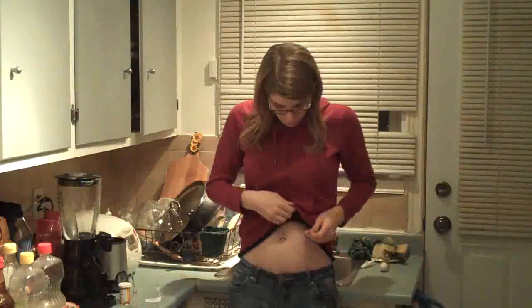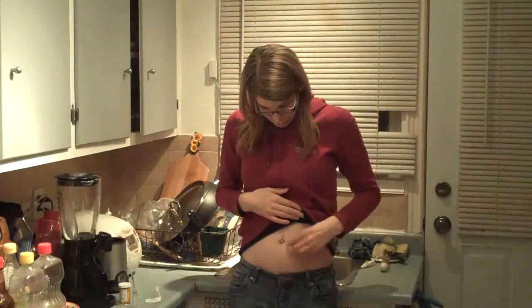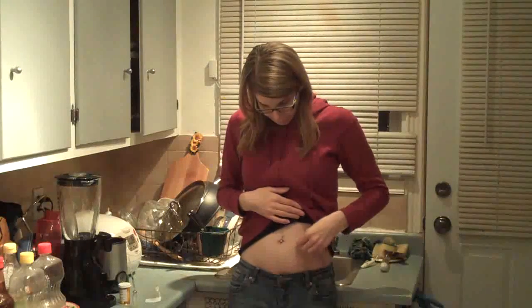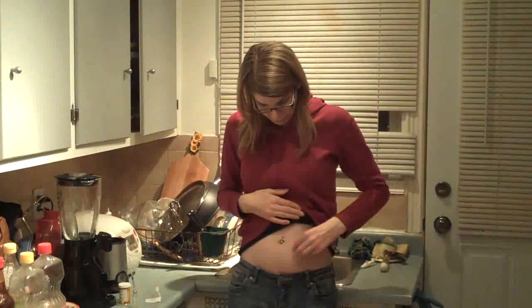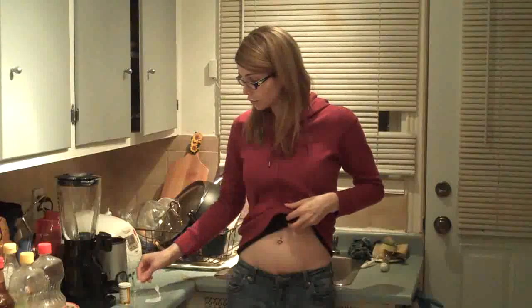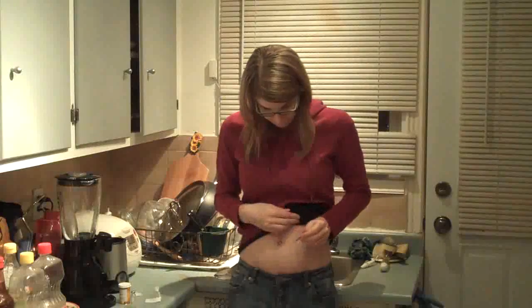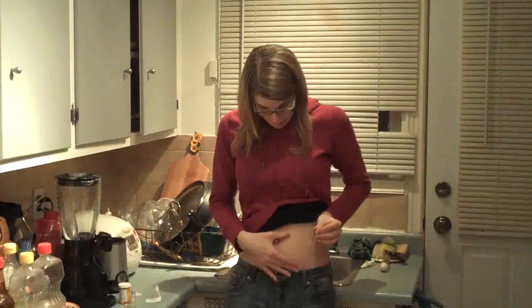I try to inject on the left side one week and on the right side the next week — alternating so it doesn't get damaged too much on the same side and to give it time to heal. So today I'm going to inject right about here on the left side. I'm rubbing the alcohol pad here to disinfect my skin, then leaving a little time for the alcohol to evaporate before I do the injection.